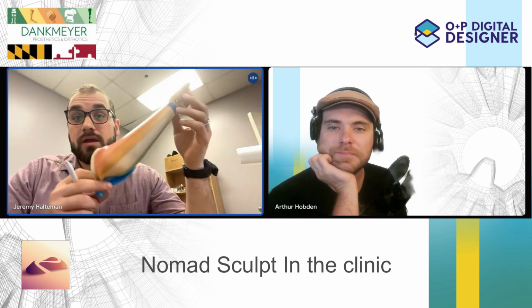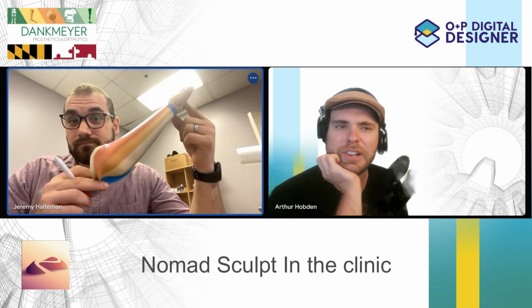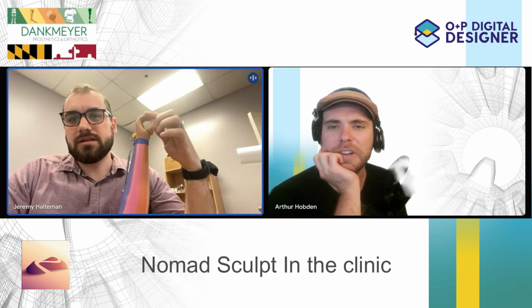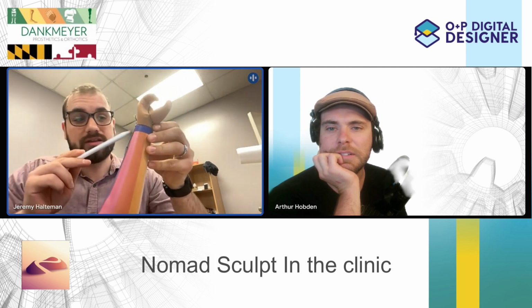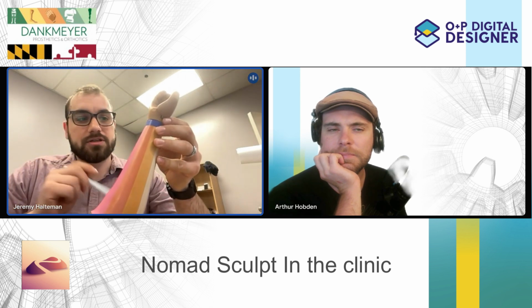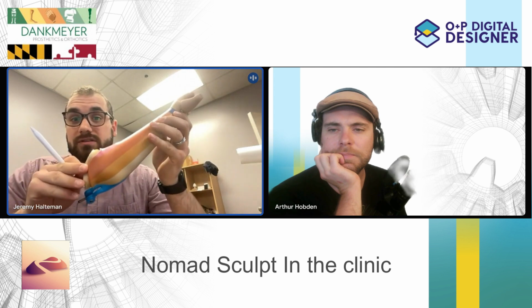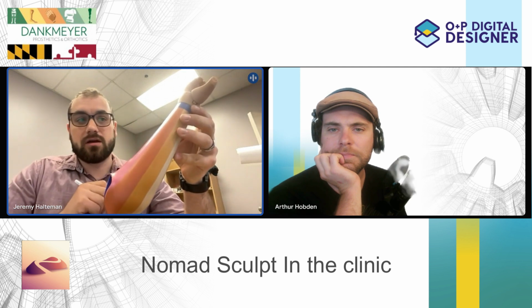But yeah, this arm was completely designed in Nomad. Even the hand? Not the hand. No, the hand is just a TRS hand that we purchased. And also the wrist. The wrist is an example of where we designed the wrist in CAD, brought that in and did a Boolean operation to Boolean it into the mesh. But everything else, inside, outside, double wall, all that was done with Nomad.